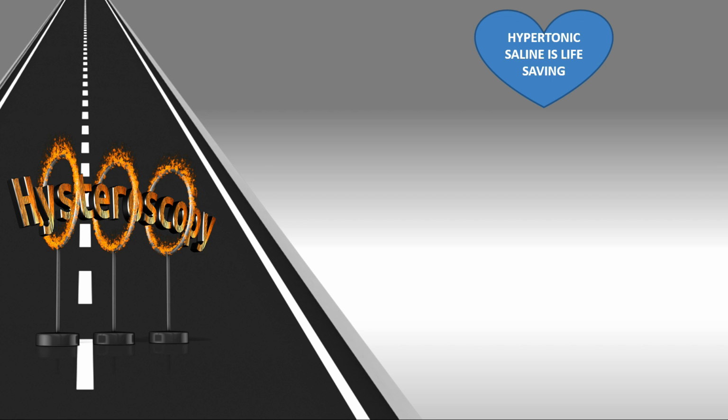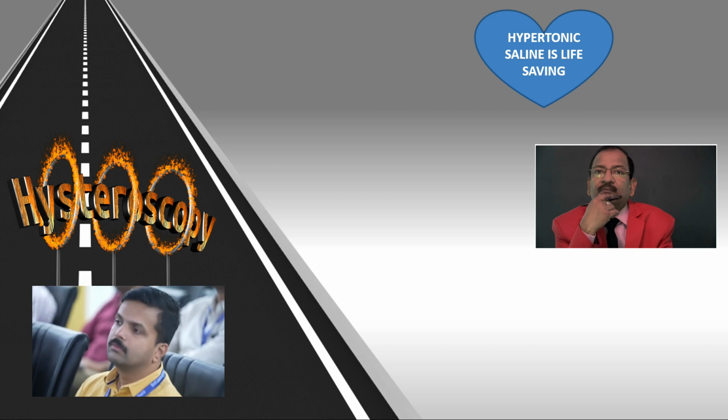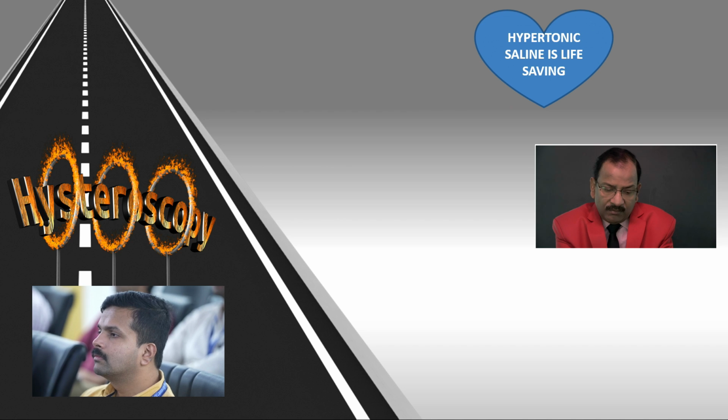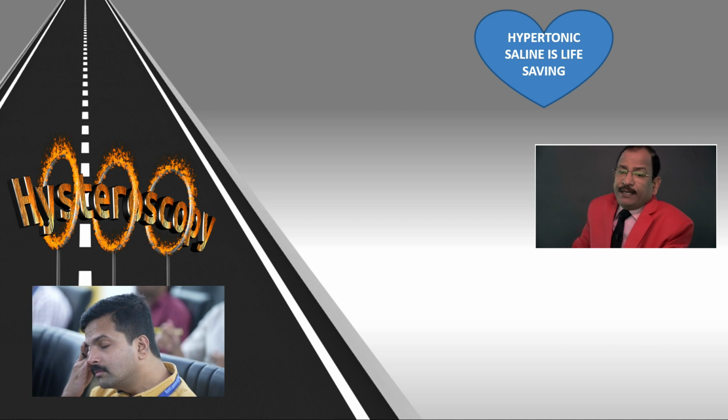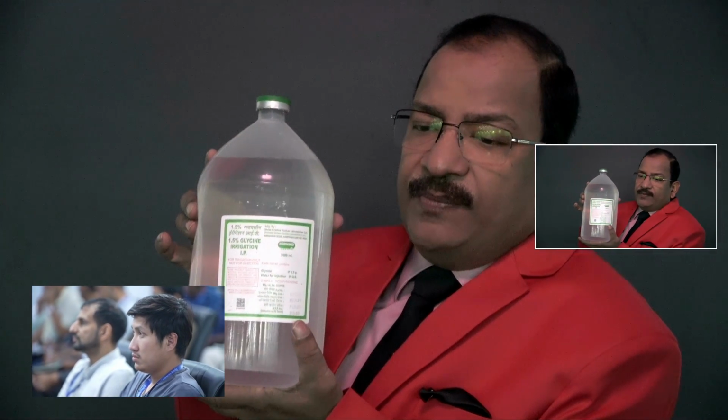Prevention. Now, coming to the treatment. If suppose it has already occurred, then what will you do? If already occurred, then immediate treatment is a must. You can see here, this is the bottle of glycine, this comes in a 3 liter bottle. This is 1.5% glycine. Some people use 3% also, but 1.5% is better, safer.